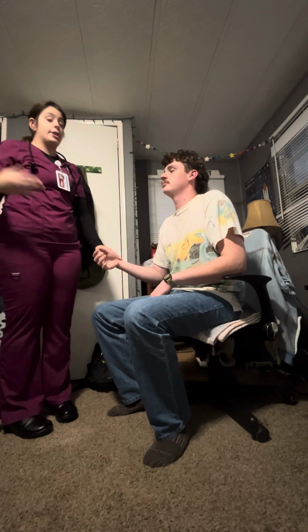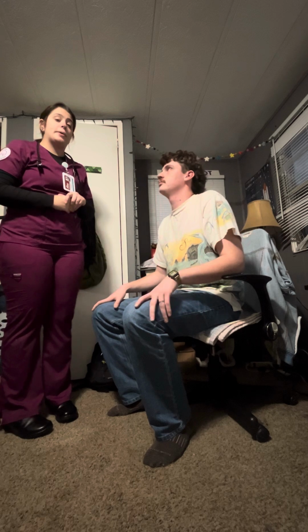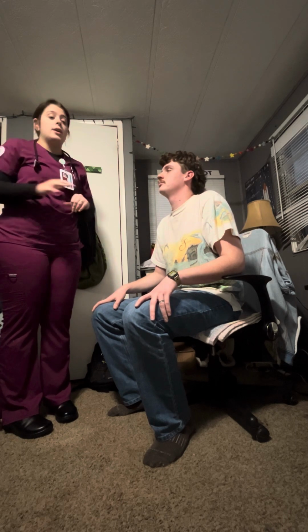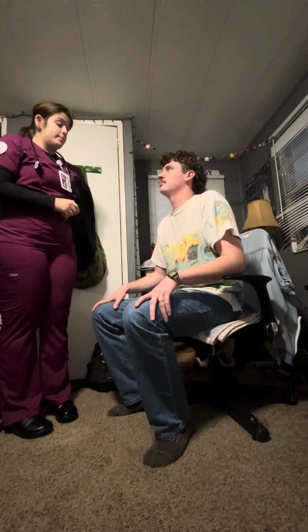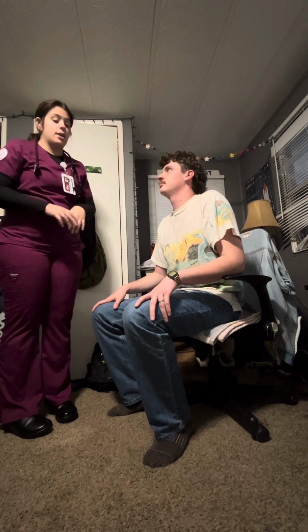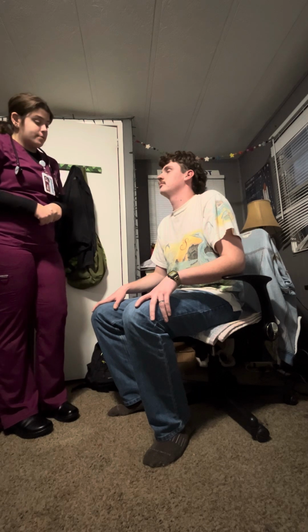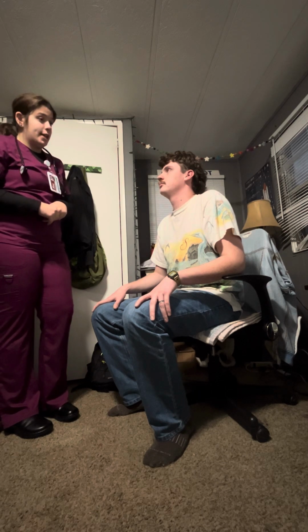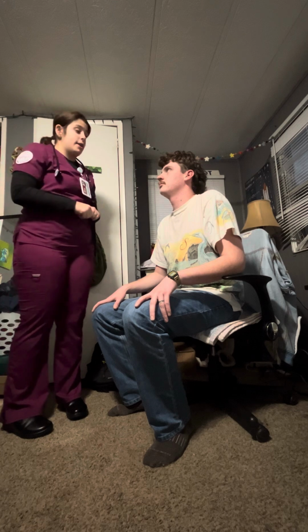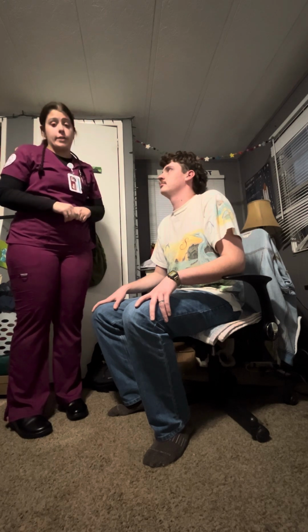I'm then immediately going to go into taking his respirations. His respirations should be anywhere between 12 and 20. They should have a normal rhythm, and it should be a normal depth, so not too shallow and not too deep. I'm then going to take his pulse oximetry. His oxygen saturation should be between 95 and 100.